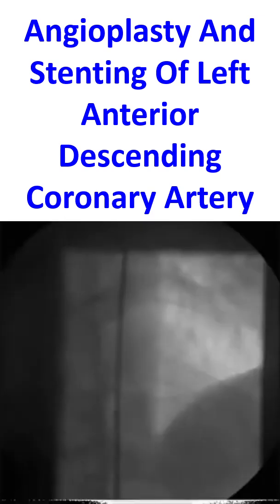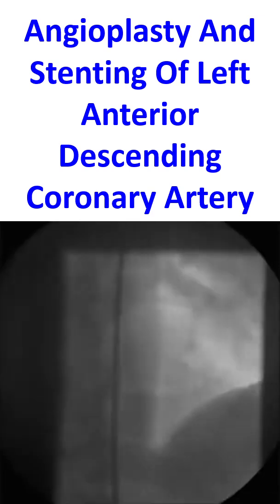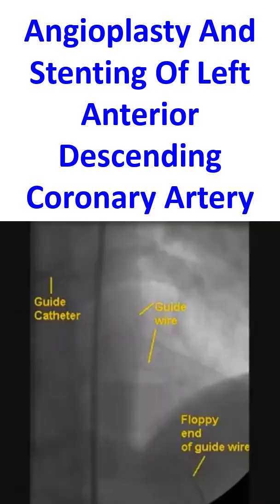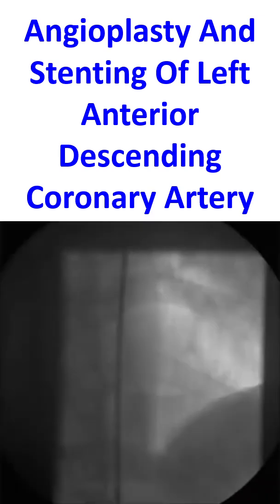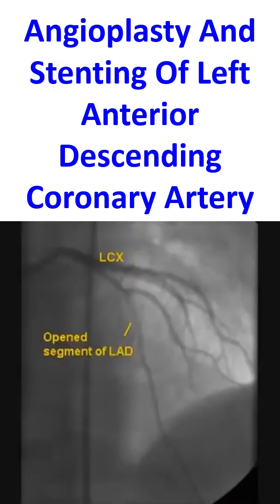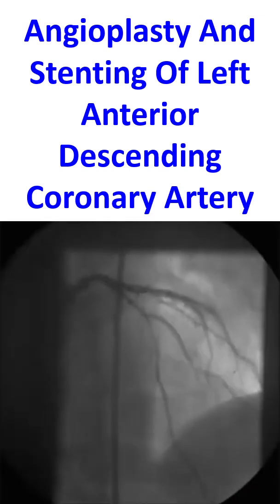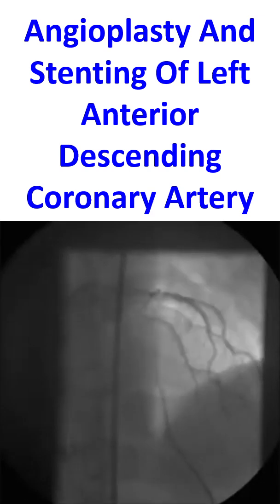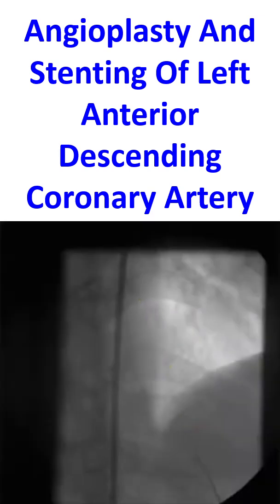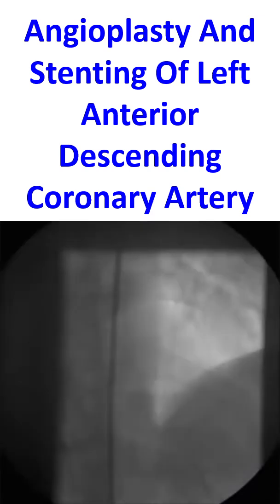Left coronary angiogram in PA postero-anterior cranial view showing a totally occluded left anterior descending coronary artery stump — the LAD stump. Also visible is the LMCA, left main coronary artery, the diagonal branch of the LAD, and the LCX, left circumflex coronary artery.